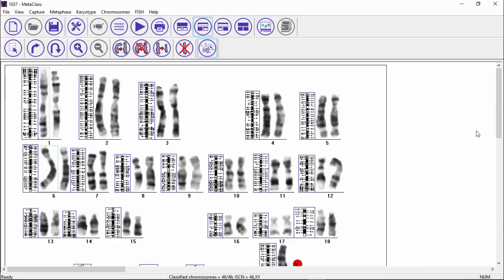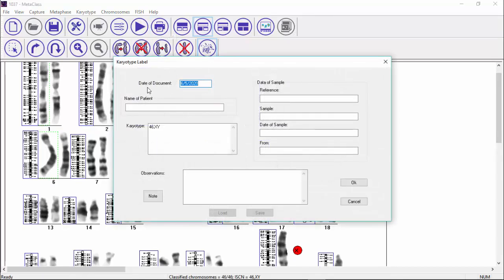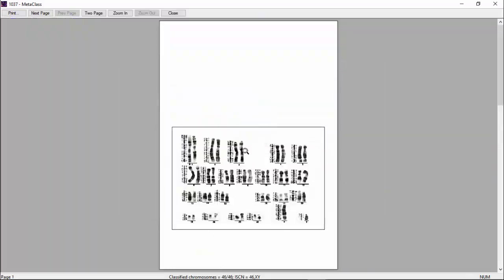So from here, for example, if I want to just see the report, I go here in the report. Here it asks me all the information of the patient, other fields that will go directly to the database. And here you can see the report.